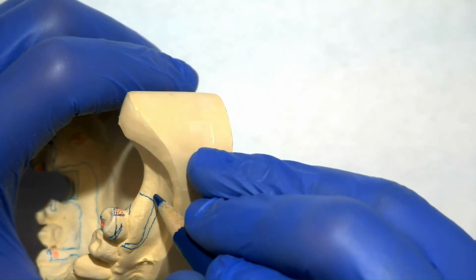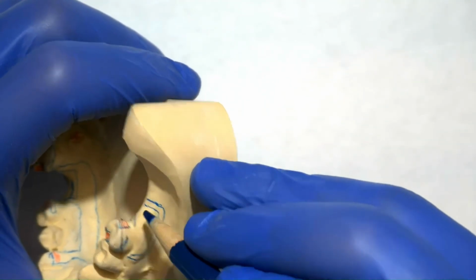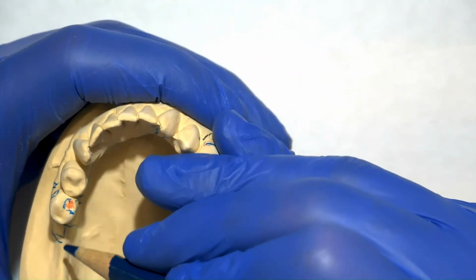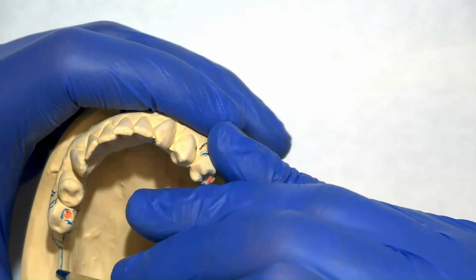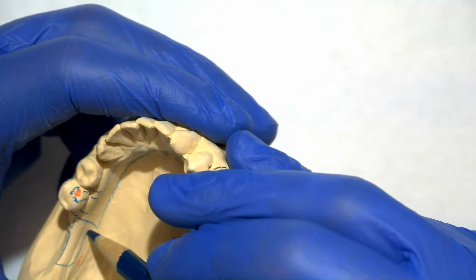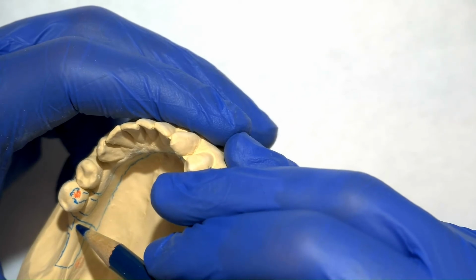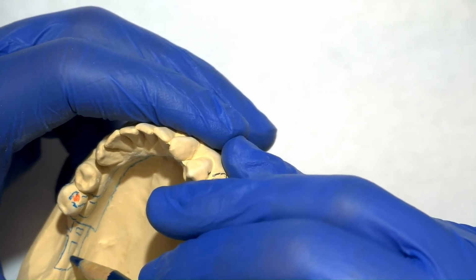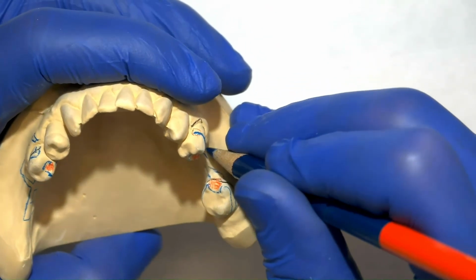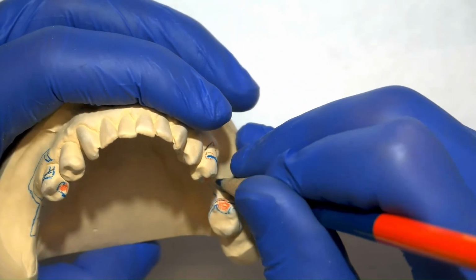Now that we're done with the origin of the modified T, we're going to go ahead and start drawing the lattice. One side of the origin is going to connect to the guide plate here, and the other side is going to go along the crest up until we start to slope upwards with the retromolar pad, and then we're going to turn around and go back towards the finish line, leaving a little edge there free from the finish line just so that we can join it with the denture base later.